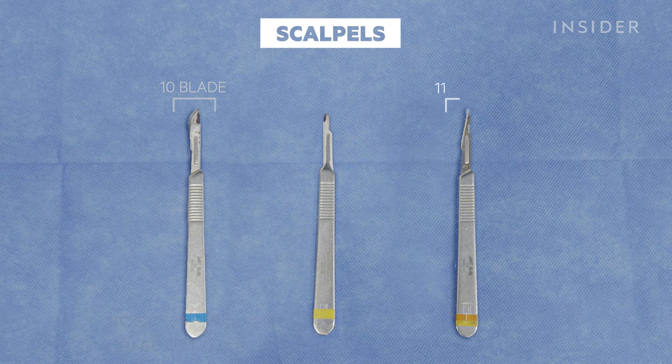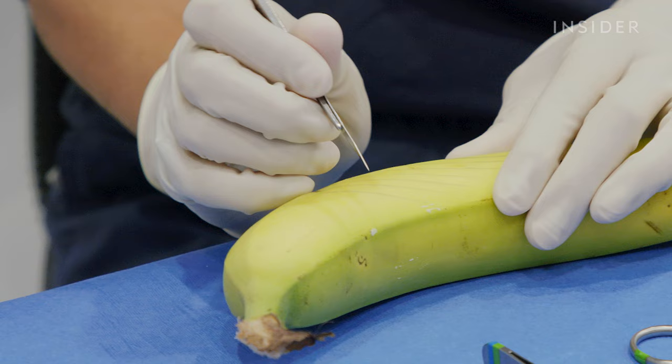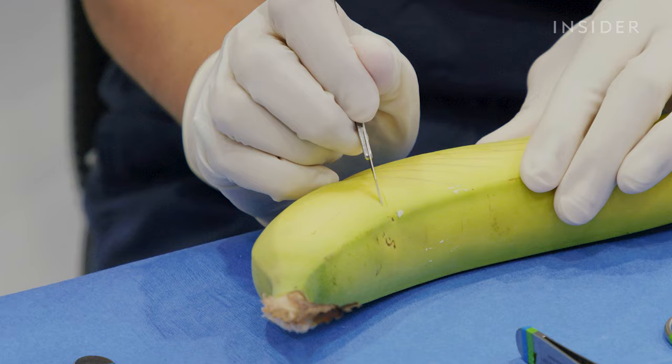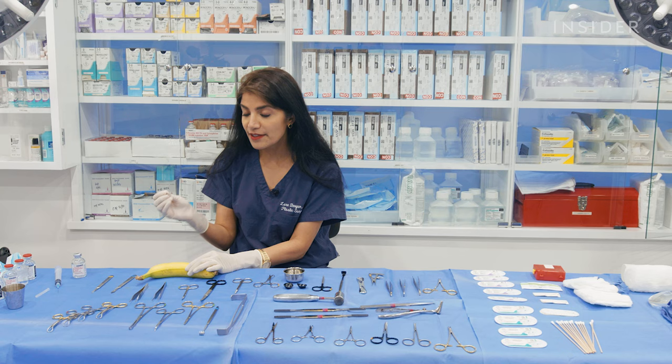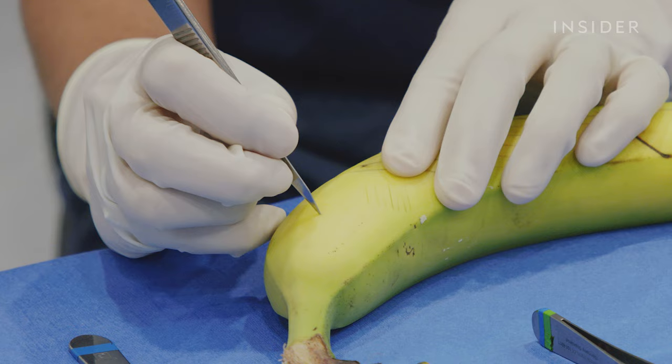This is an 11 blade, and as you can see, it has a very fine and sharp precision point that goes all the way to the tip. So it's much more appropriate for tiny little precision cuts. Like for a blepharoplasty or a lip lift, you can really carve something extremely fine with an 11 blade.